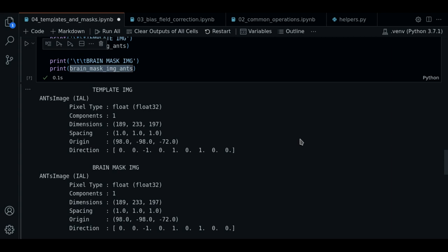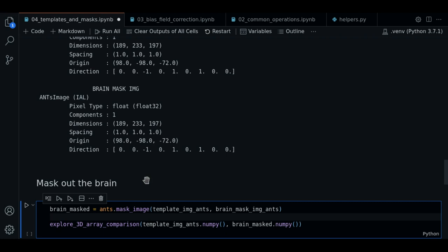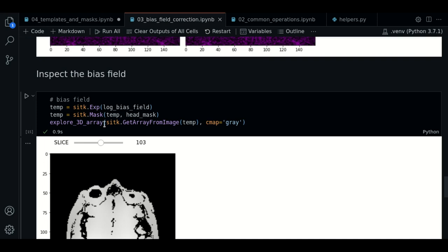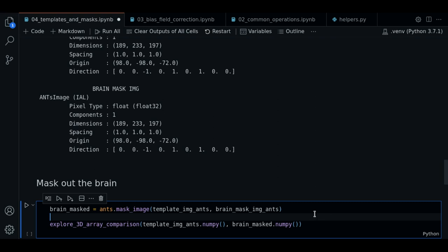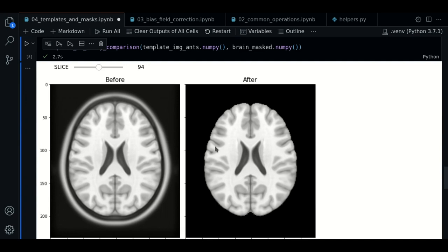So now let's learn how to mask the brain. This is the process where we use a mask and the raw image to generate a new image containing only the brain. We already have seen how to do masking. If we go to our bias correction notebook, remember we had the log bias field and we masked it with the head mask. But now we're going to do it with ants. We're going to use the function ants.maskImage. We pass the image we want to mask and the mask, and this should give us the result. We're going to use the explore3darray comparison function to see the result.